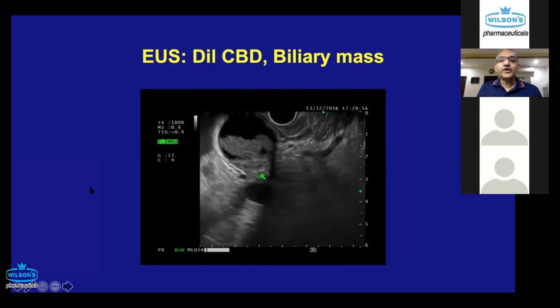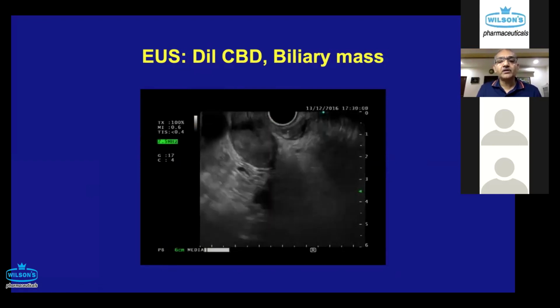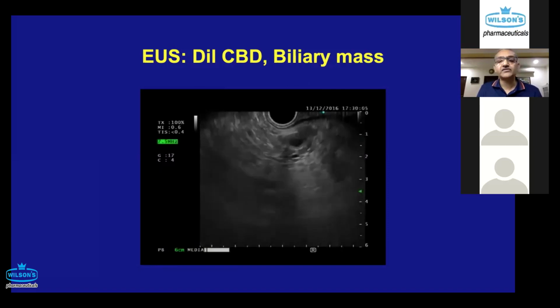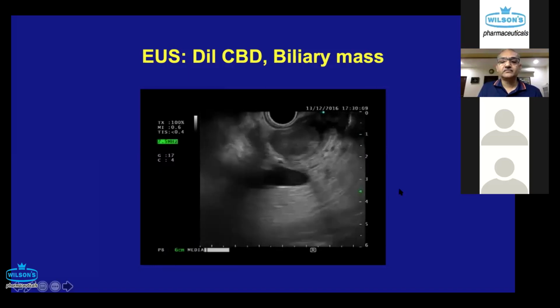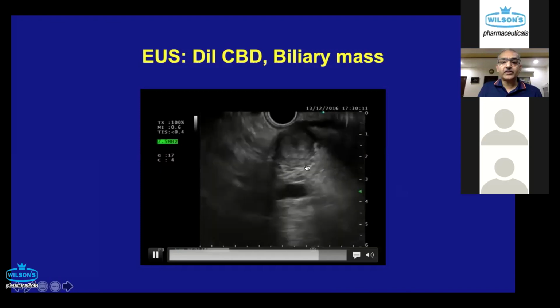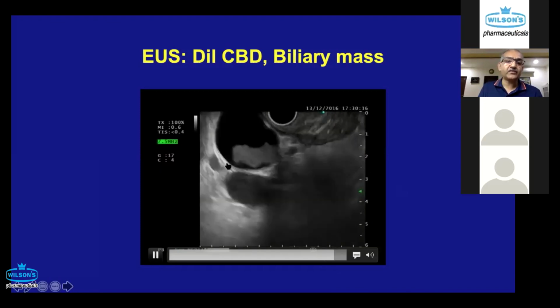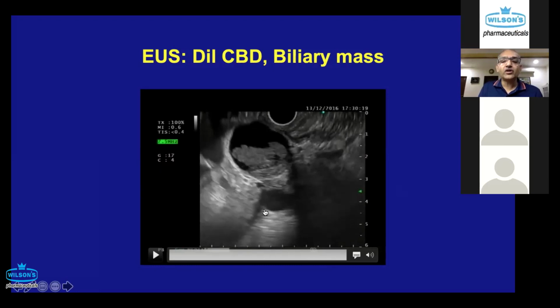So this was a variant of a cholangiocarcinoma, which are much rarer compared to the fibrostenotic type of malignancies which involve the bile duct. I'm showing all varieties of it. On the look of it, it looks to be resectable. The portal vein behind is not invaded at all. There's no lymph node, and so was confirmed on other imaging, and he underwent a successful surgery.